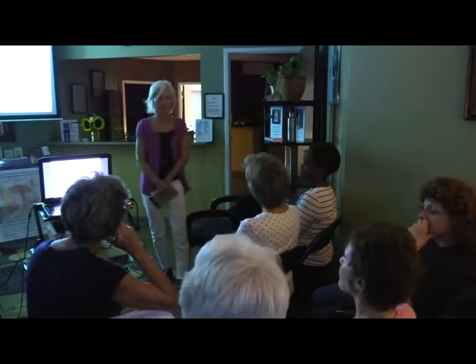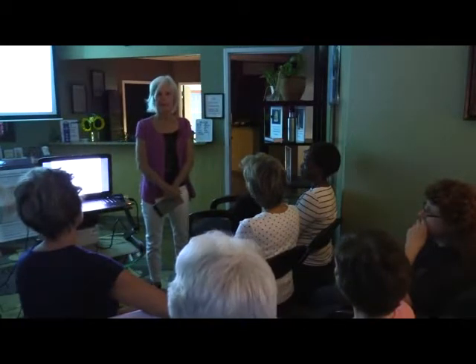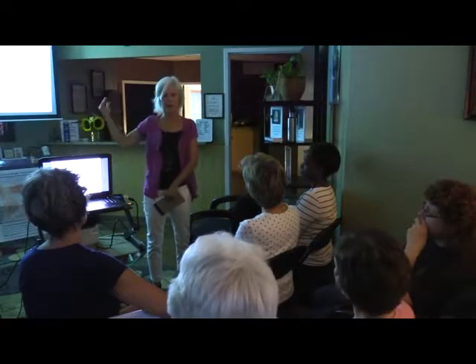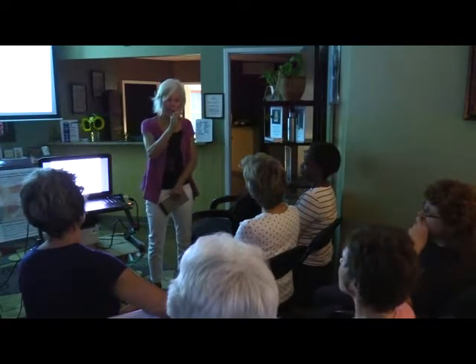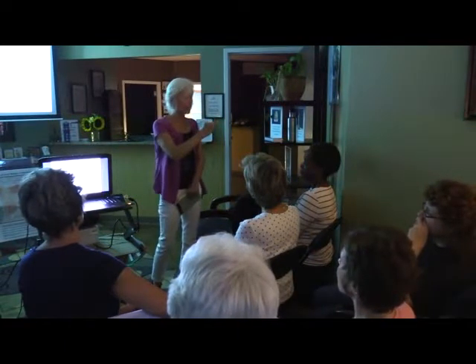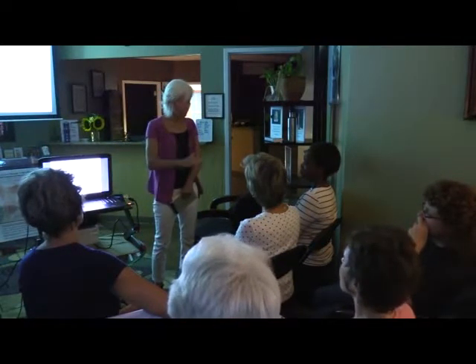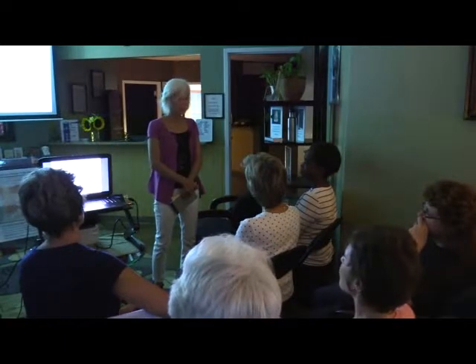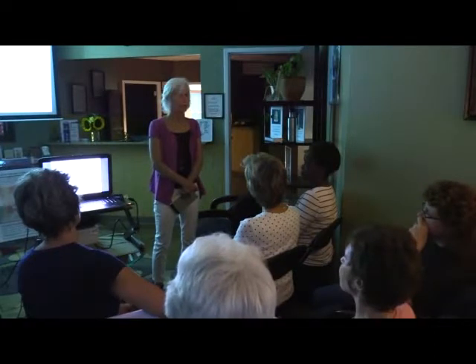My Dr. Wren has picked it up. When I say doctor, he's seen a lot of these. Not everybody can look. And it's all about comparison. You can see I always put up before and after. We've got to compare. When I do a follow-up thermogram, I re-image the exact same areas as on the initial thermogram in order to see what difference has been made. We want to see those numbers go down, those heat differences. So I have to be very exact and measure the exact same areas so I can compare apples to apples. Any other questions?